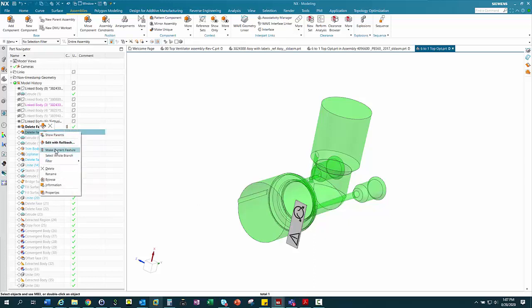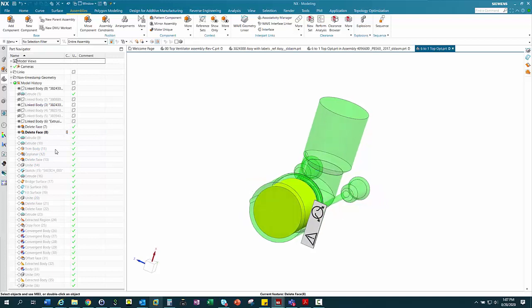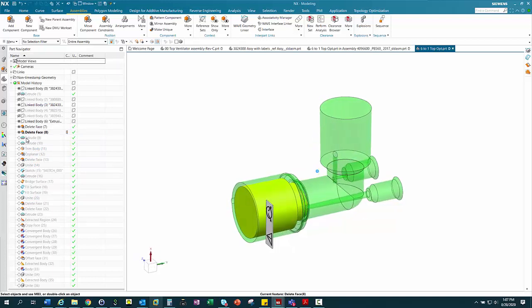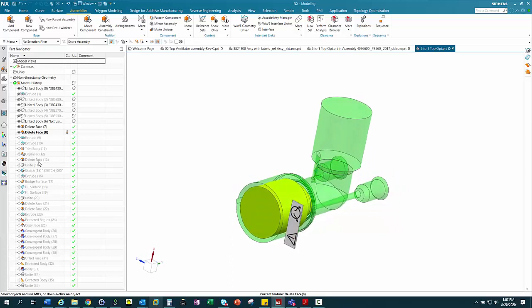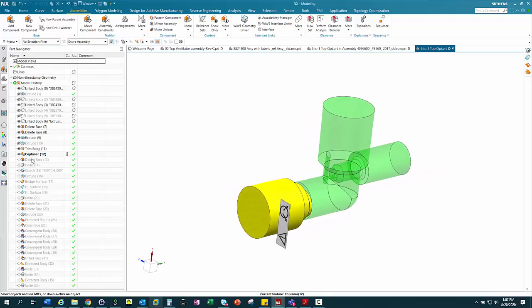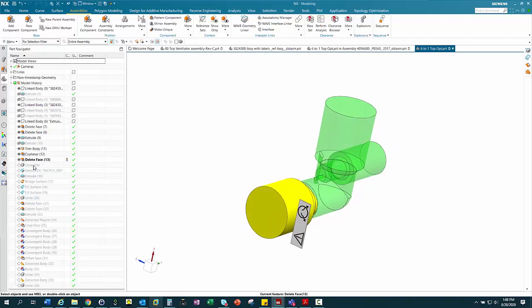And then we were able to do the same with the other part so that we could combine the 2 parts together, and then we could kind of like start making design changes using synchronous technology to get the information that we need.